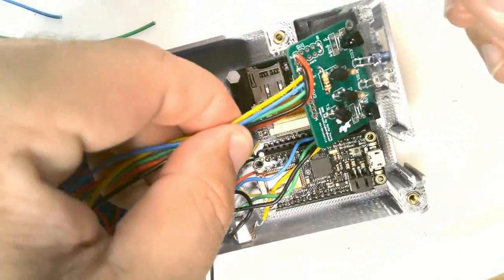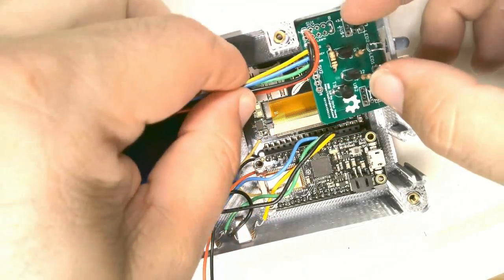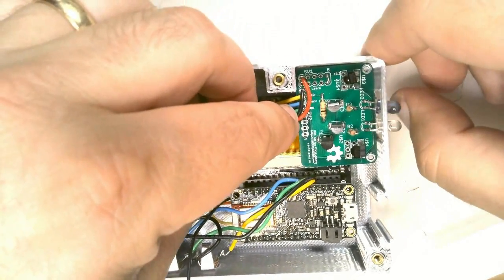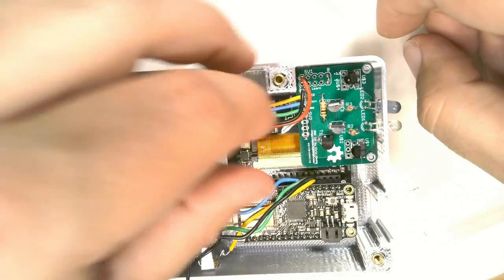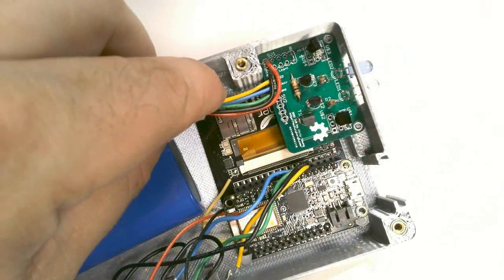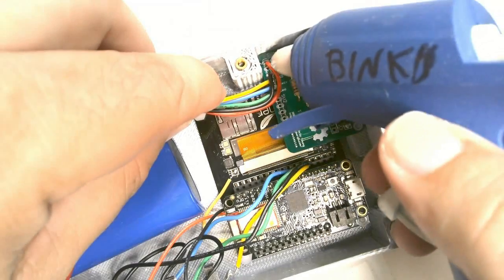Next, we insert the infrared board into the case. There's a separate video that shows you how to construct this board. See the tutorial for details. Secure the board in place with a drop of hot glue.